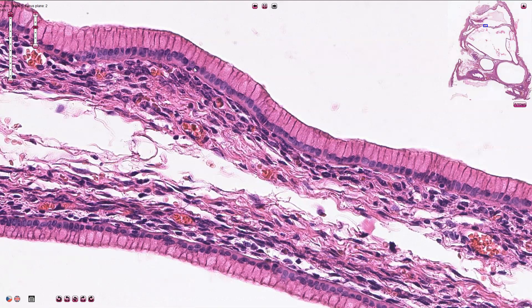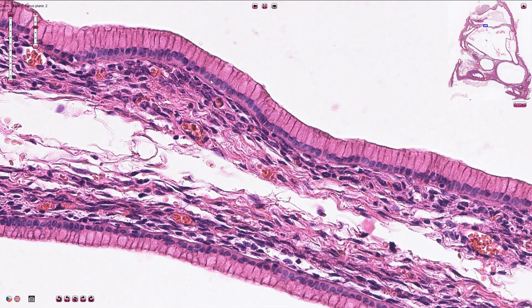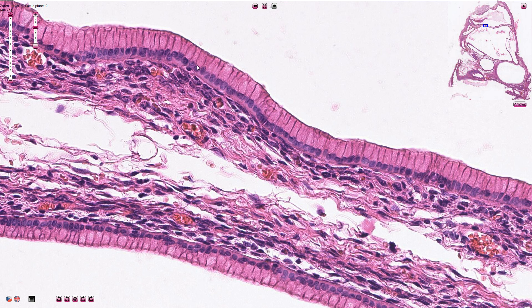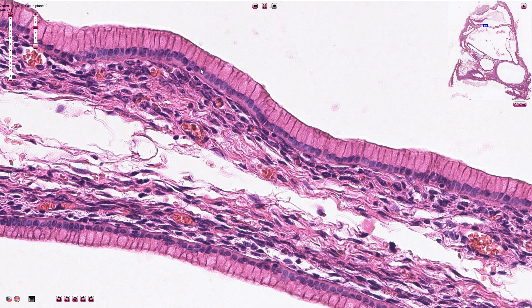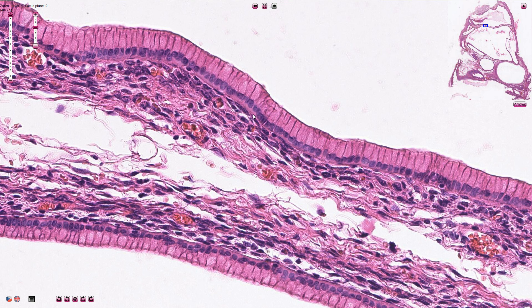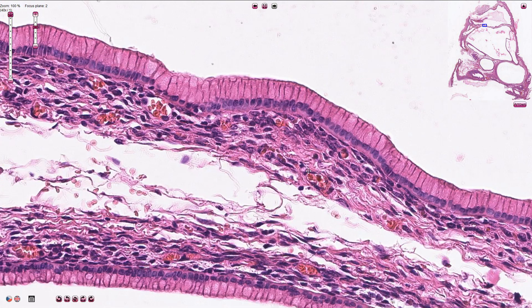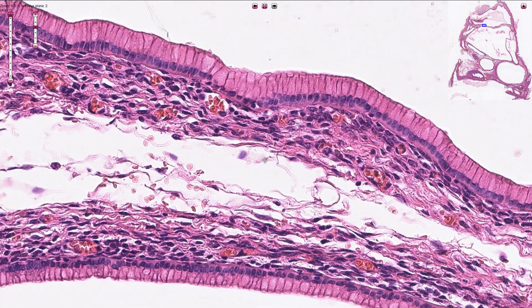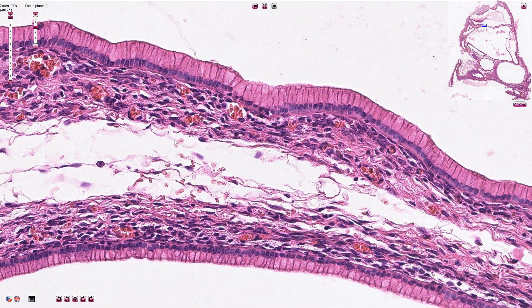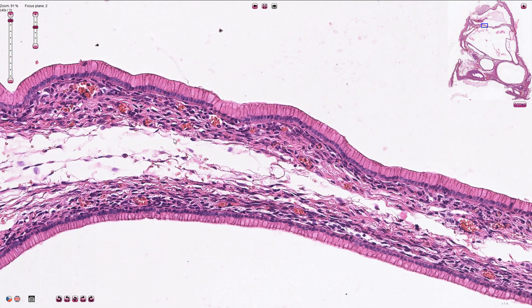The nuclei are not hyperchromatic, they are not atypical, and all of them are in the basal part of the cells. The basement membrane is intact and there are no cytomorphological atypia. So this is the typical appearance of the mucinous cyst adenoma.